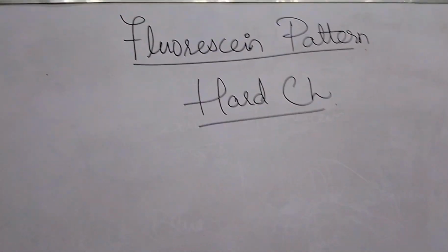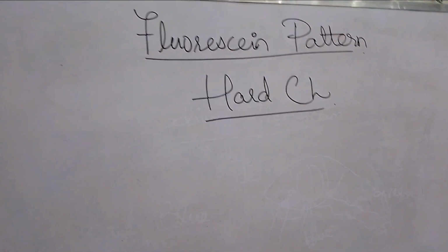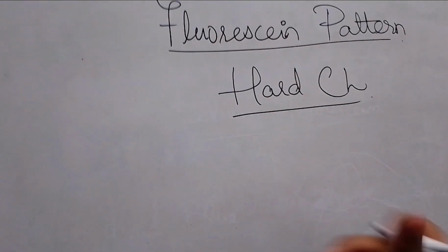As we are discussing the fluorescein pattern in hard contact lenses, you all know that hard contact lenses are smaller in size.